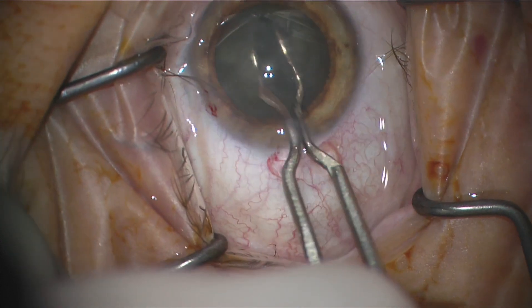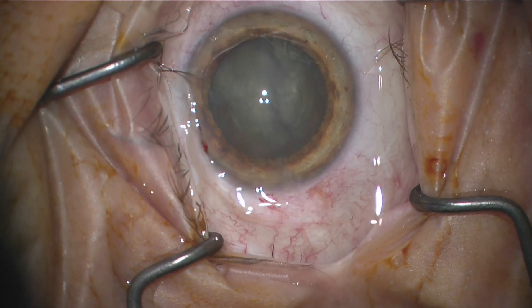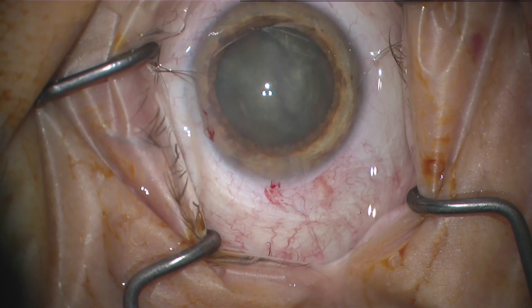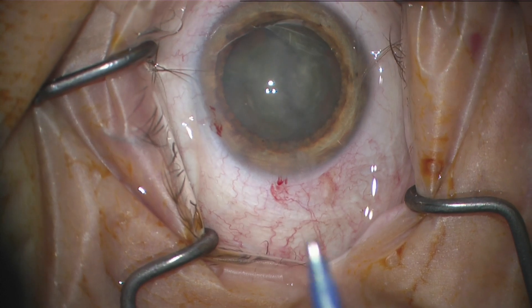You can do it without pre-chopping but it's just harder because it's a little more difficult to chop with this device, and it's nice to actually have pieces to eat into.